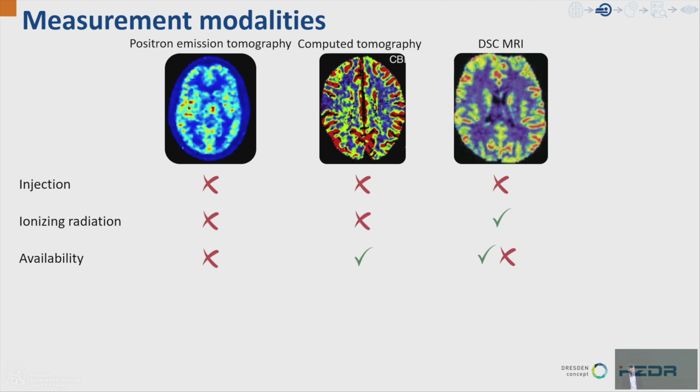It's nearly impossible to do water PET in hospitals with real patients. And while DSC MRI is used very often, it brings certain issues, like concerns about gadolinium deposition in the body, and it also brings some extra costs. Moreover, DSC does not allow absolute quantification of the flow, and is not easily repeatable within the same session.